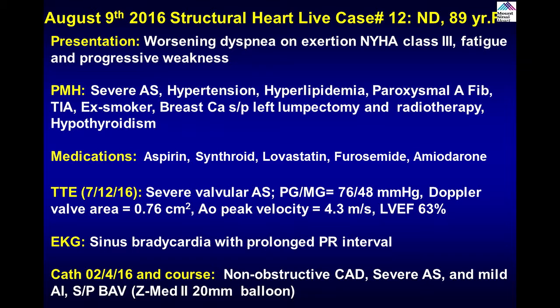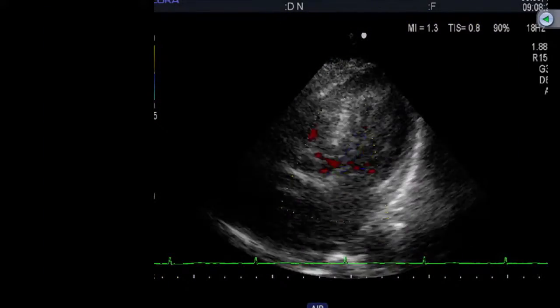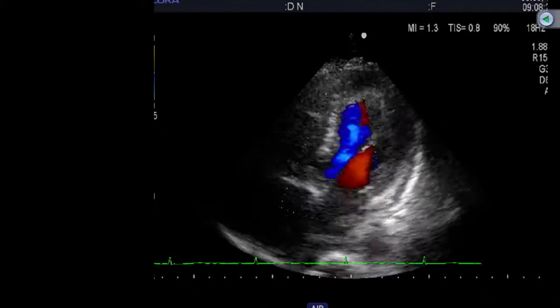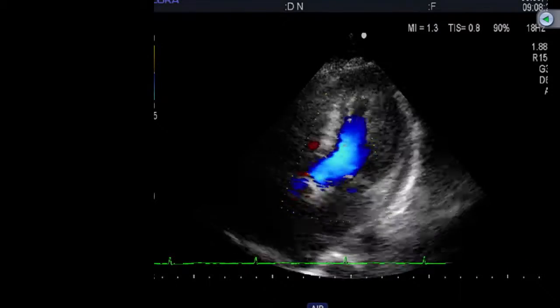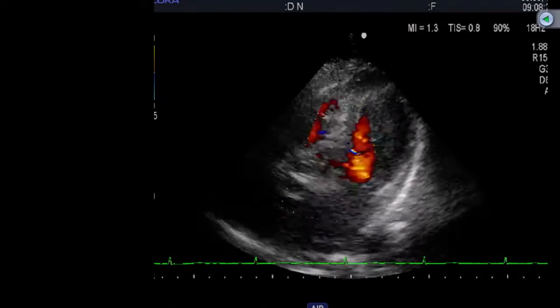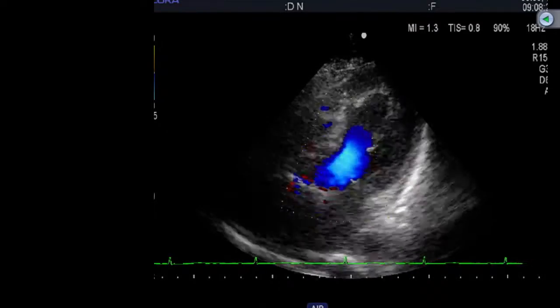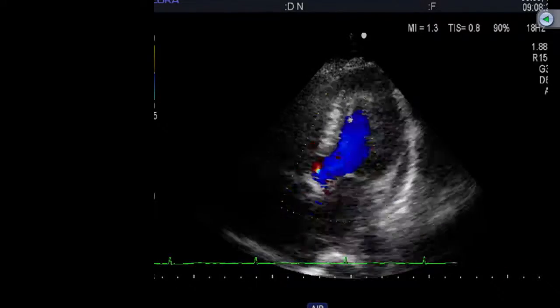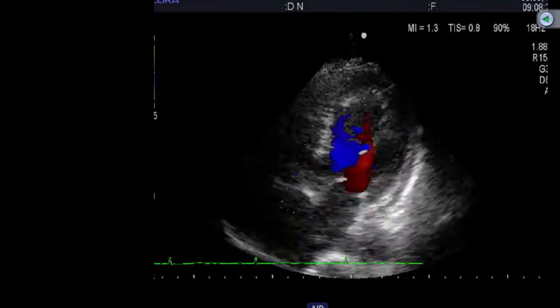And the patient has severe aortic stenosis, which we can see by the echo. If we can show the echo now. I did the balloon valvuloplasty actually a few months ago when the patient initially presented. So Partho, you... This patient has severe aortic stenosis. We are doing this procedure under conscious sedation, under transthoracic guidance, so there will be a very minimal role of imaging during the procedure in this case.